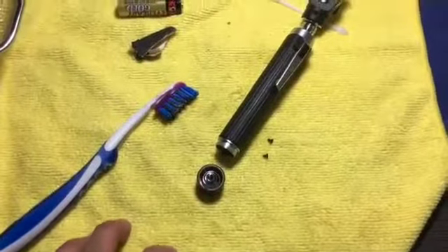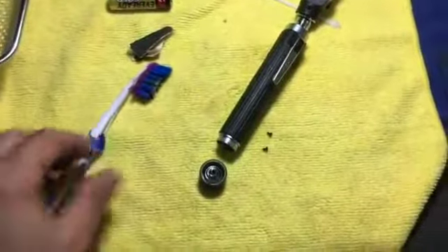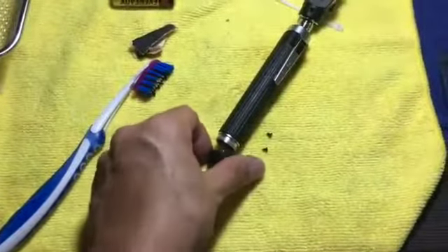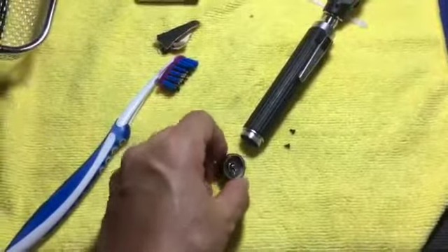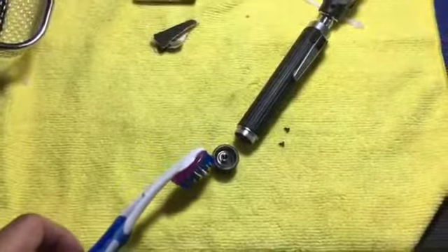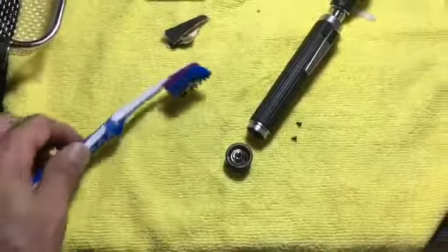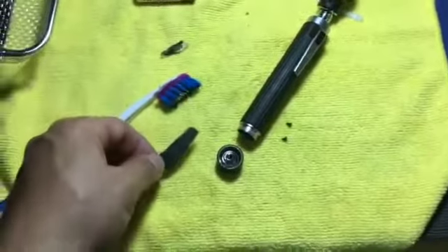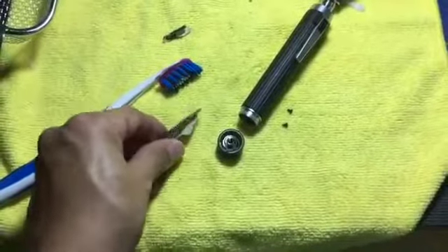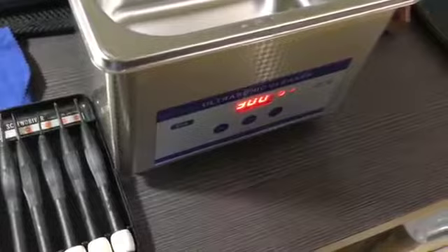What happened was the battery compartment has been eroded with unused batteries. So the first thing you need to do is unscrew the cap. I use baking soda to remove the deposits and a small toothbrush, and if it's resistant I use some sandpaper. Then I use my ultrasonic cleaner to clean the part.